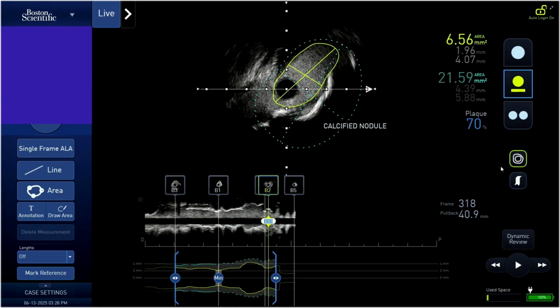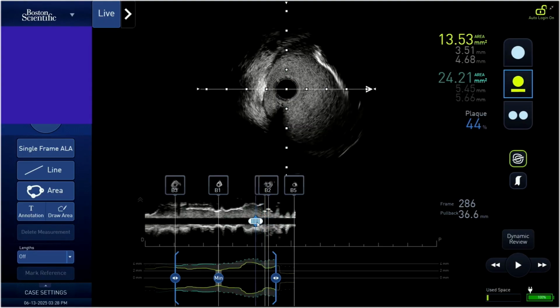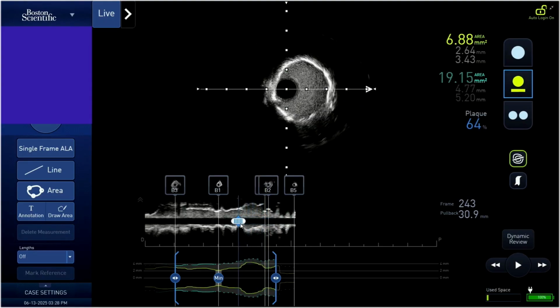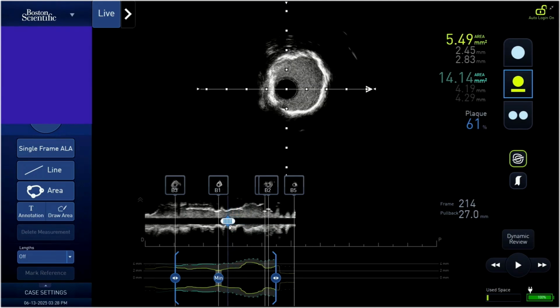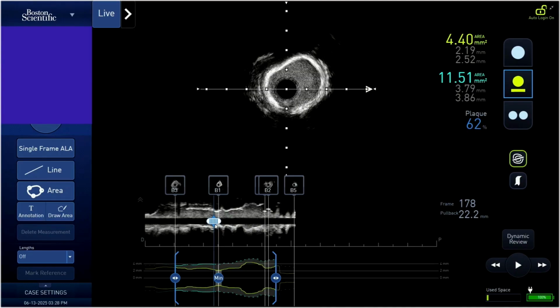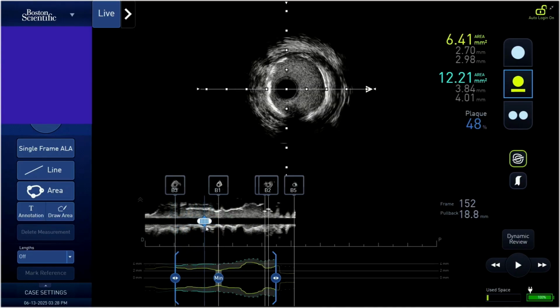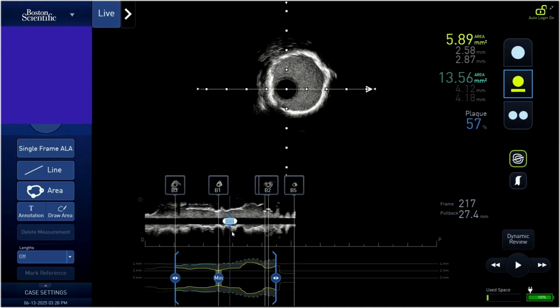Sure. So now go inside. This is a bifurcation, and this is the ostial LAD. Wide open. And here is the previous stent. There's 360 calcium, but area-wise it's around 3 point something. It's a borderline LAD. Okay, so now, this was a little surprising to us.